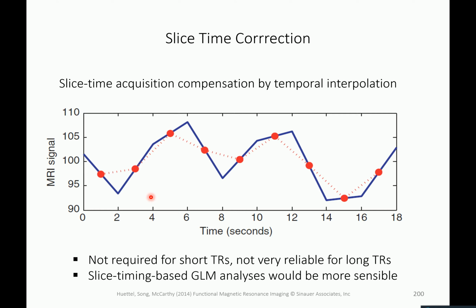Because everybody studies clinical aspects of, I don't know what. So this is the story about slice time correction. You can read blogs about it online. I never do slice time correction because it's not really worth it.